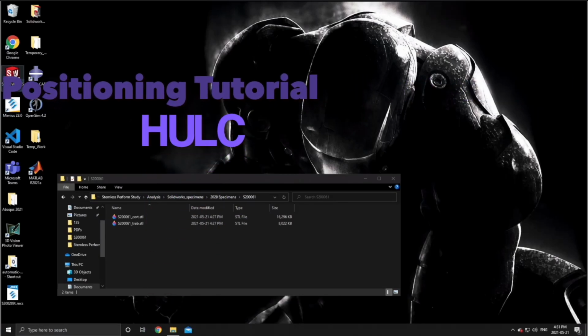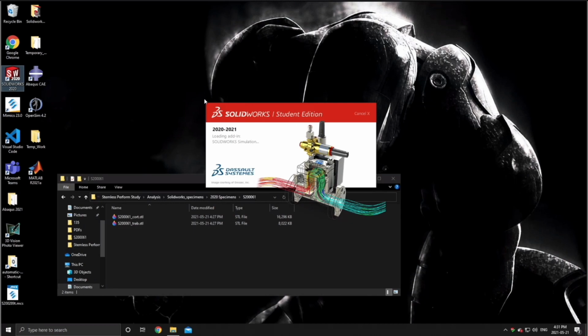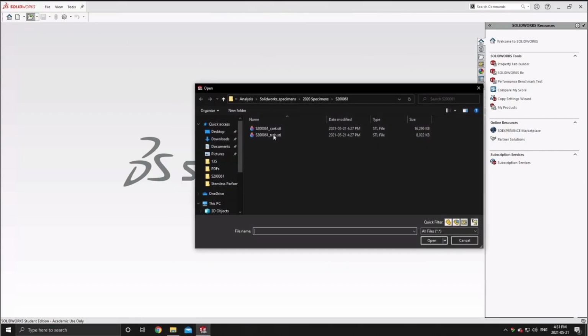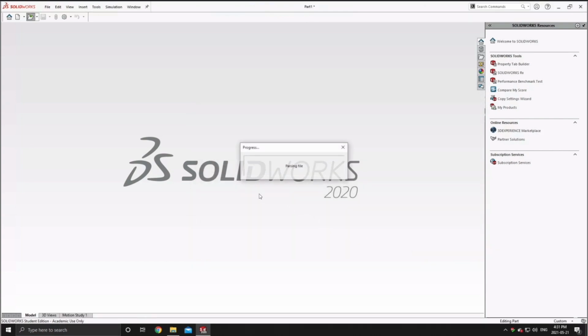Okay, welcome all. We're going to be doing another tutorial, but this time on humeral implant positioning, or positioning of orthopedic implants in 3D bone models.